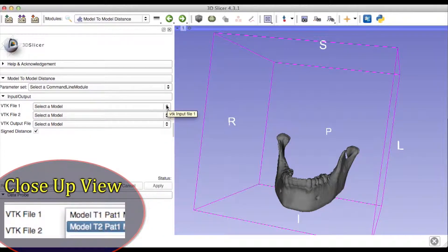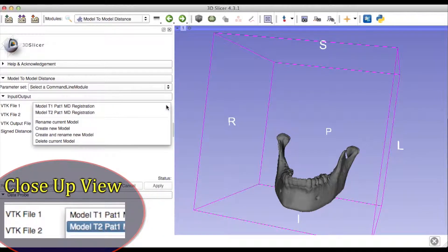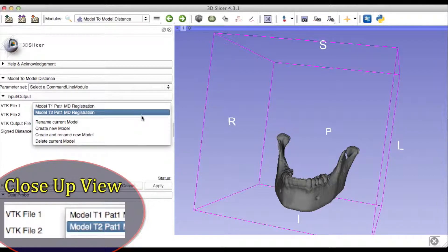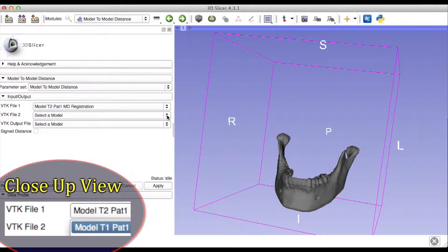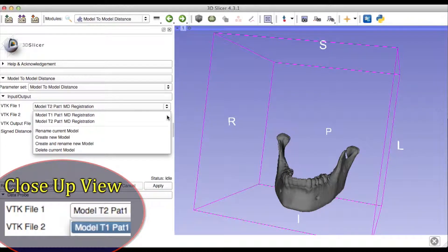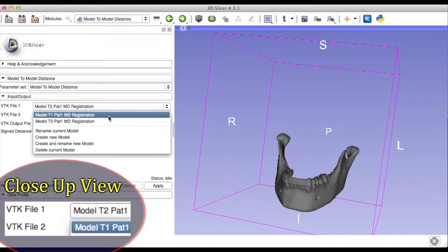For the VTK File 1 option, make sure you select the second time point, and for the VTK File 2 option, make sure you select the first time point. This inversion is necessary because the color map will be created in the file selected in the VTK File 1 option.